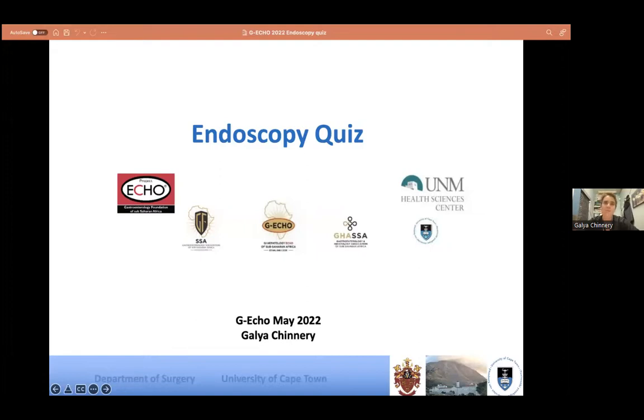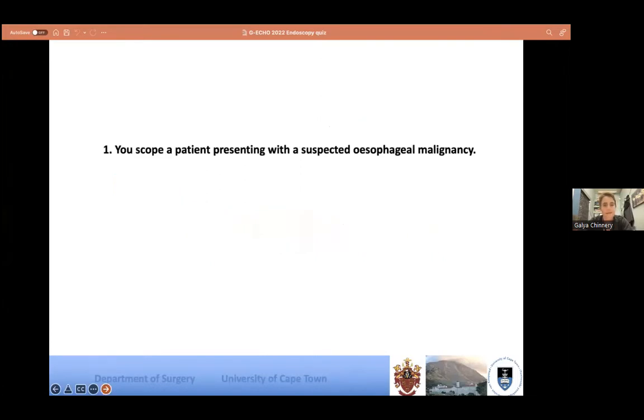I've got some random questions to ask about them, and basically it's just to test yourself. And I appreciate that the beautiful endoscopy pictures that you see in endoscopy atlases don't always realistically show what it's like. So let's get going.